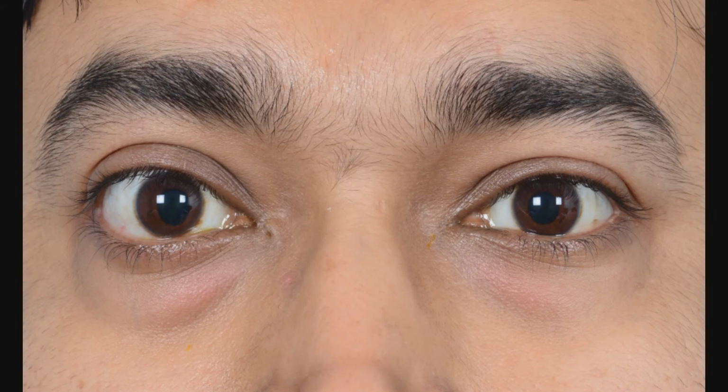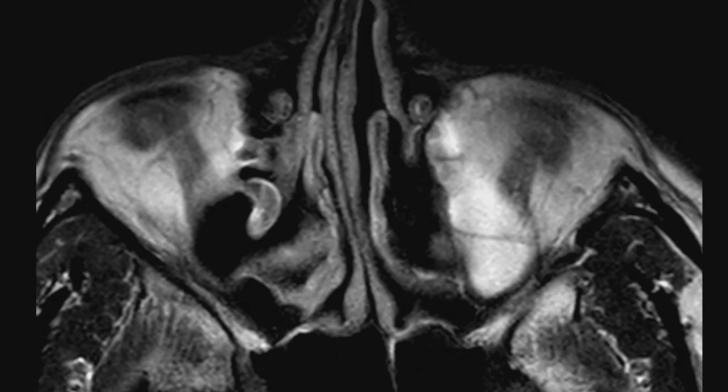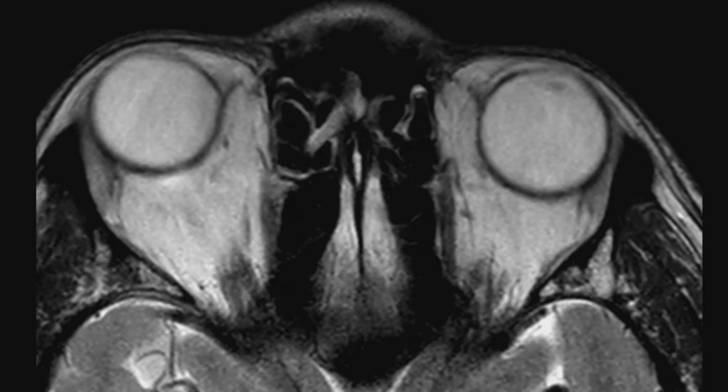As clinico-radiological correlation is mandatory to understand, let's discuss some of the major pathologies that we come across for a deeper and better understanding. Here is a 34-year-old male with right eye axial proptosis, disc edema and choroidal folds. On MRI, a well-defined intraconal mass causing right-sided proptosis was seen, causing compression and displacement of the optic nerve superonasally.